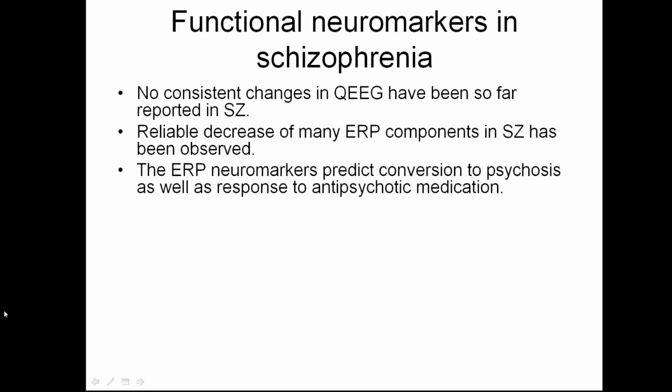And basically, we were not able to see large differences. So overall, the EEG spectra don't show large effect sizes, large differences. But in contrast, quite large differences were found, and here it is.